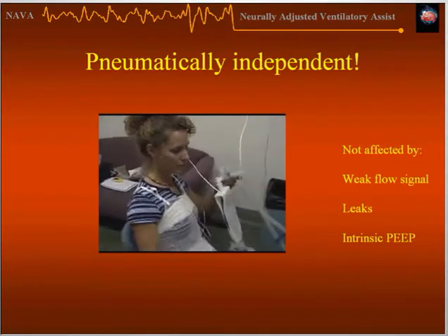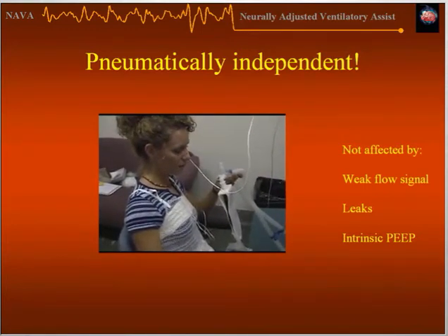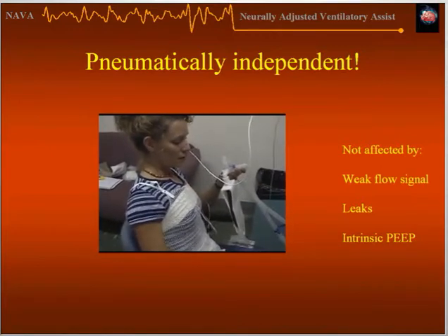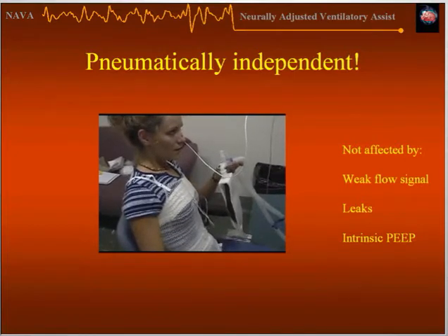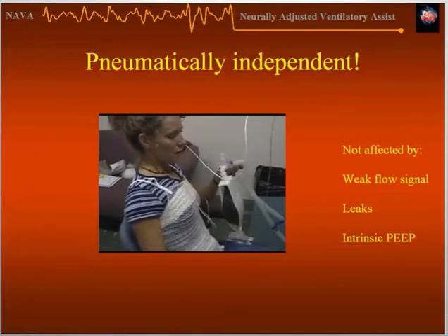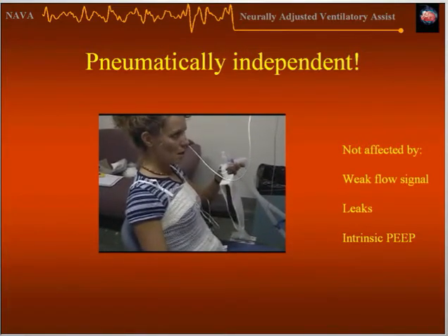This contains the wires for the electrical activity. And the girl is breathing. You can see her chest moving. And you can see how the chest wall is synchronized to the lung model. A bigger leak than this, I don't think, can exist in the world.